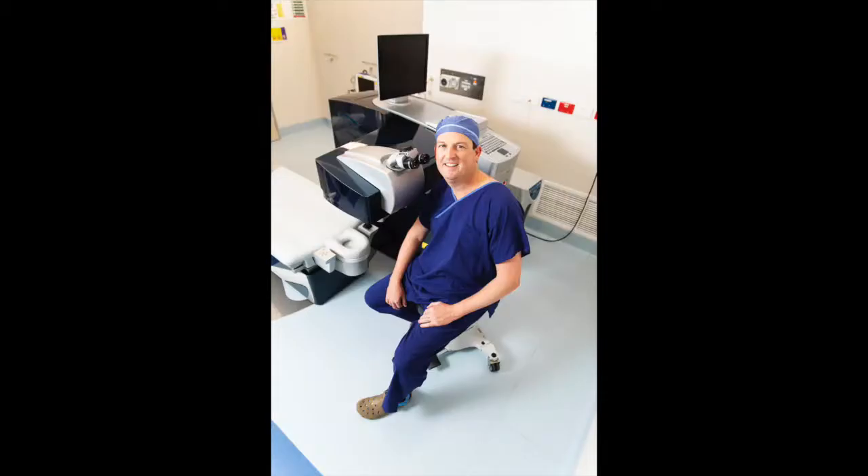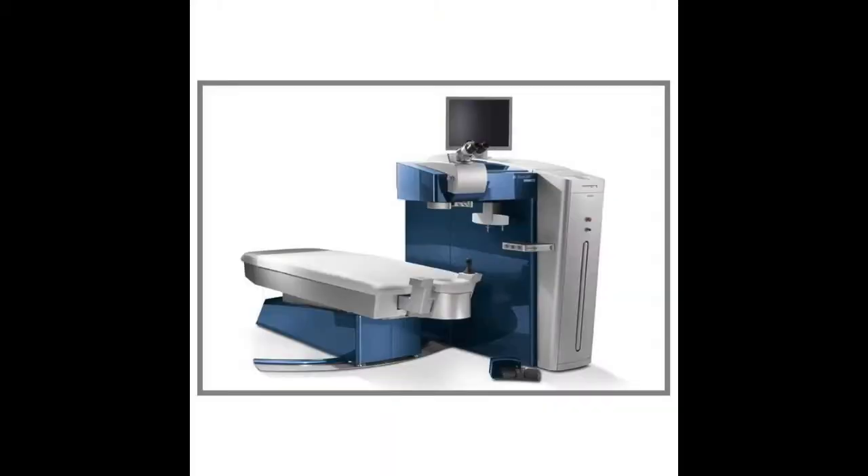This is the room the procedure is done in. The procedure involves a very expensive laser called an excimer laser — it's amazing technology. Most people know the laser as the machine used for LASIK or laser eye surgery to get patients out of glasses. That's absolutely not what we're using it for in this case.